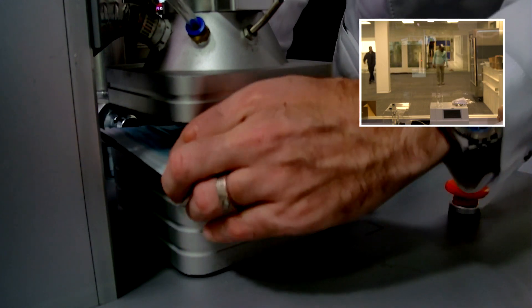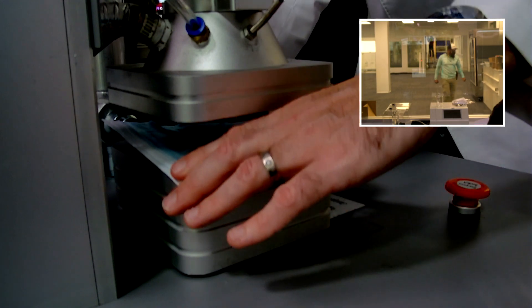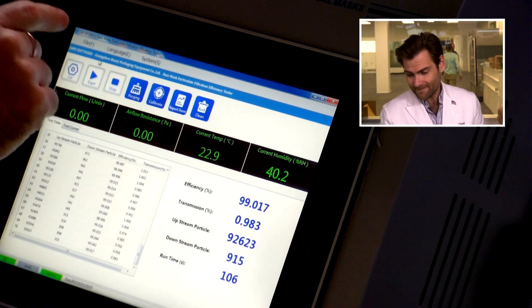This is a very small mask. I like my mask to be square, and this is a square. I'm just seeing bigger masks — the bigger the mask is, the more breathable it's going to be because there's more breathable area. Let's let her rip.